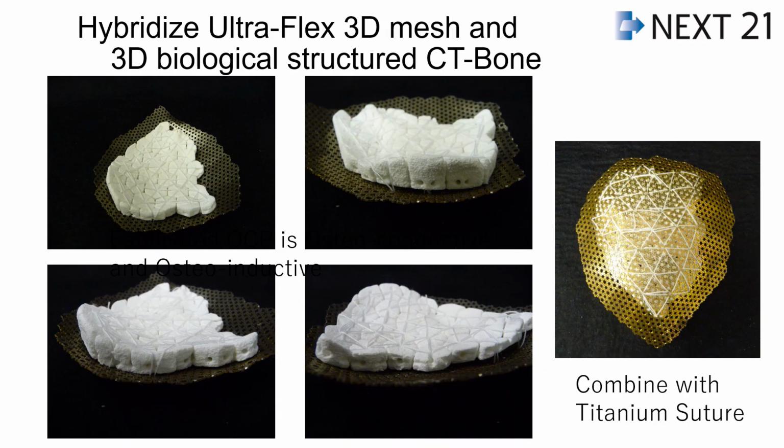A new composite implant material is made by suturing and integrating a mesh plate and CT bone into a hybrid. From the origin of its structure, it was named 3D hybrid bone matrix. When the skull reconstruction is complete and the mesh plate is to be removed, cut the sutures over the mesh and remove the stitches.